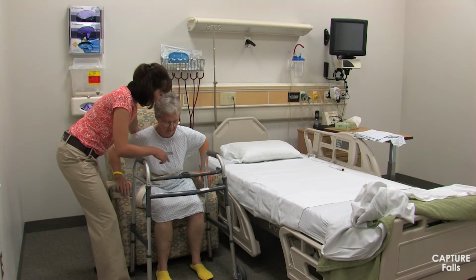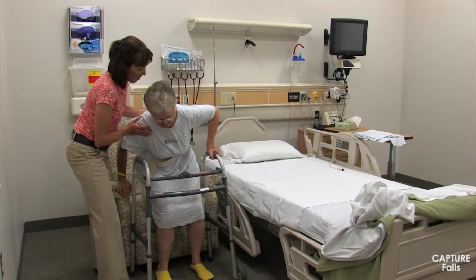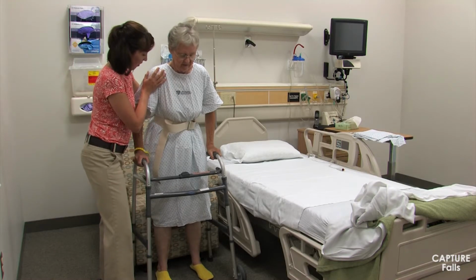As I help the patient stand, my feet are in a wide stance and I keep my back straight. I assist the patient up by using the gait belt to direct her center of mass up and forward on a diagonal. Don't simply pull straight up. This is uncomfortable for the patient and increases your risk for back injury. Once the patient is standing, make sure that both hands are on the walker. You can also quickly assess how the patient is tolerating the upright position by asking her, observing her facial expressions, and feeling how steady she is.